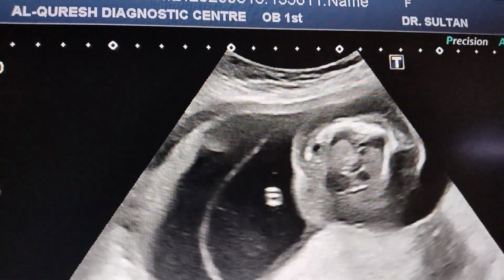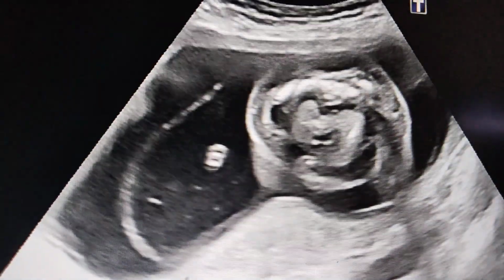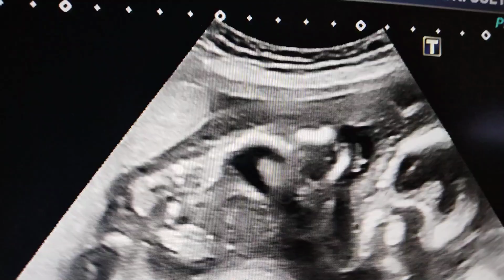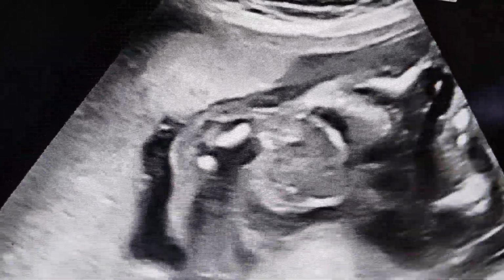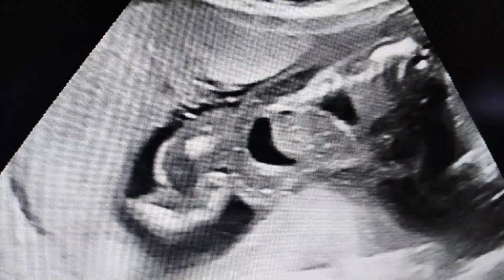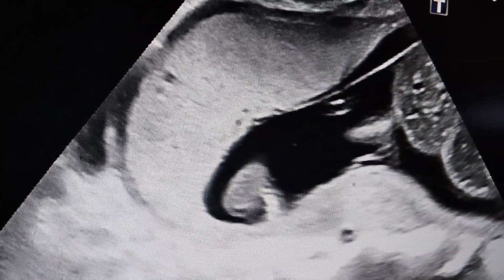So this was all about the fetus. What are the findings? Subcutaneous edema all over the fetal body, including the skull vault. Then is the pleural effusion. Then is the cystic hygroma, and then is the fetal ascites. Other secondary findings are increased liquor and increased placental thickness.